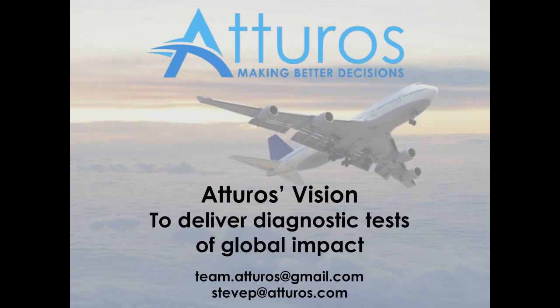And so, for example, using serum means that, at the moment, it couldn't be a test that could be done with a blood draw at home, whereas there's a possibility that would be the case if it worked on plasma. So at the moment, we're evaluating its ability to work on plasma, because that would increase the number of sites at which the blood could be drawn for use for the test.